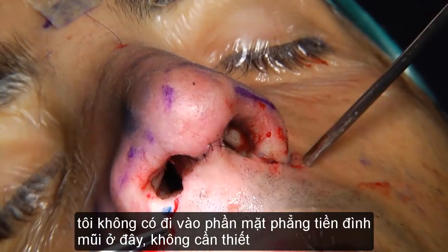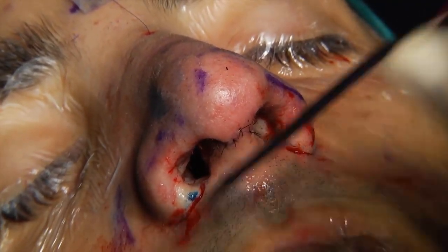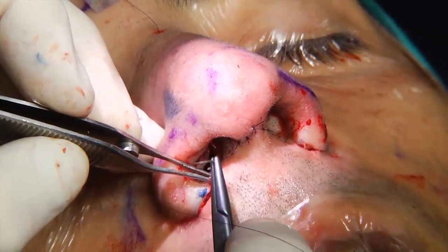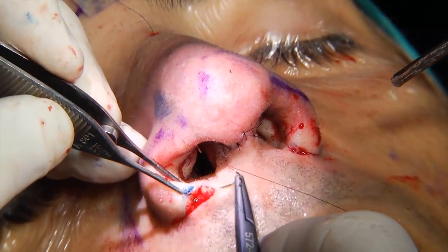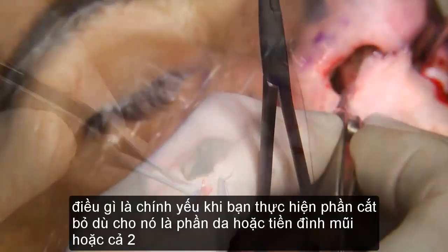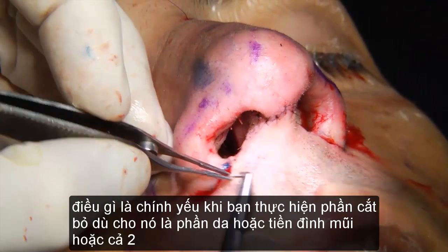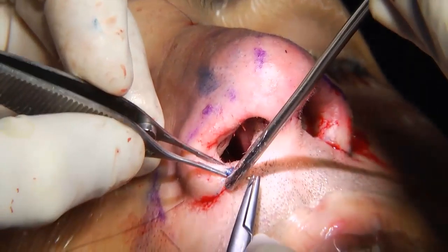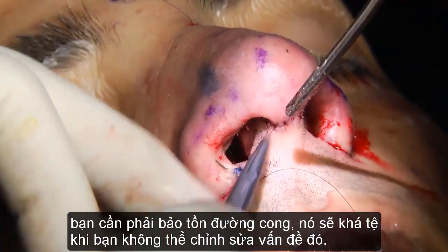See, I've not really entered the vestibular surface here, there's no need. It will just come down. One of the main things when you do these resections, either if they are alar or vestibulum or both, you really need to have this arch maintained.